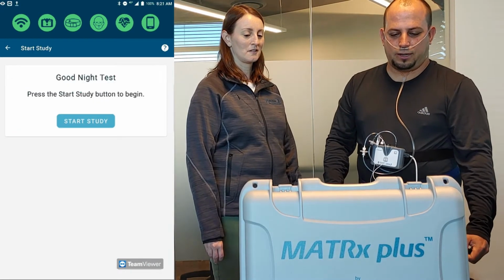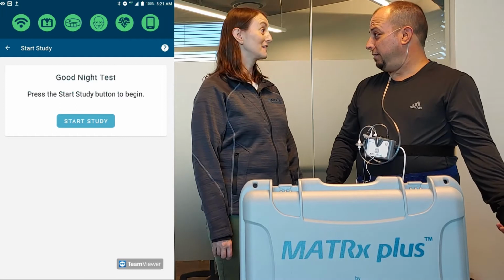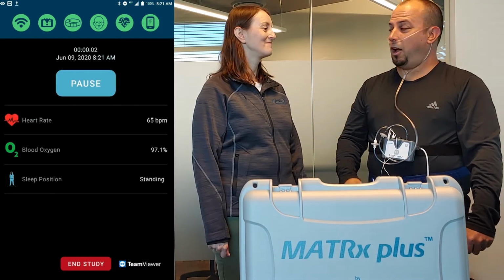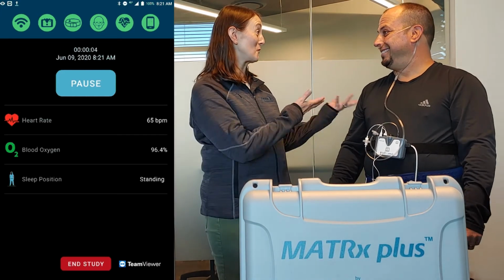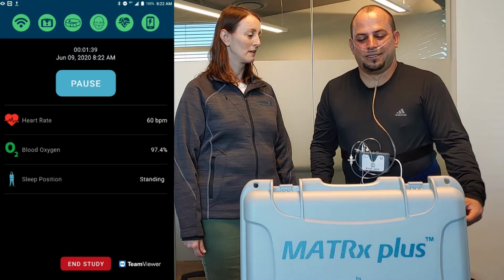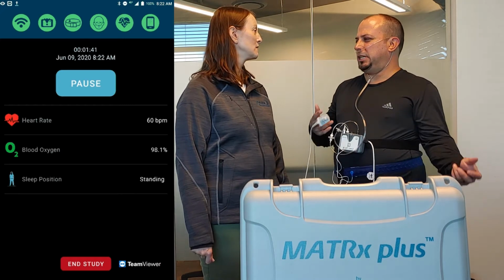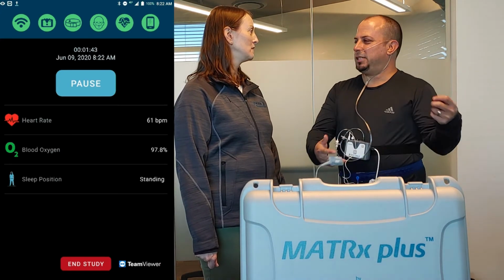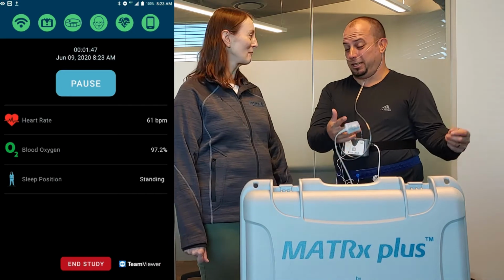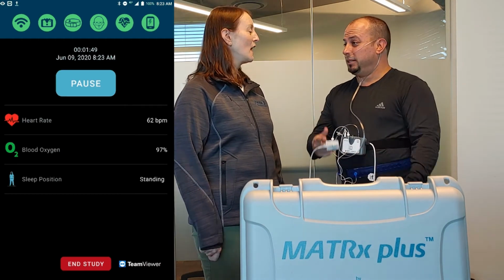Okay, it looks like I'm ready to go to sleep, so hit start study. Yes. Perfect. Your study is starting. So now you can go to bed. So my night has started. Now, at any time, I should be able to get up and make myself a snack, maybe if I'm hungry, go use the bathroom, all those things, or I can just stand up and walk away.